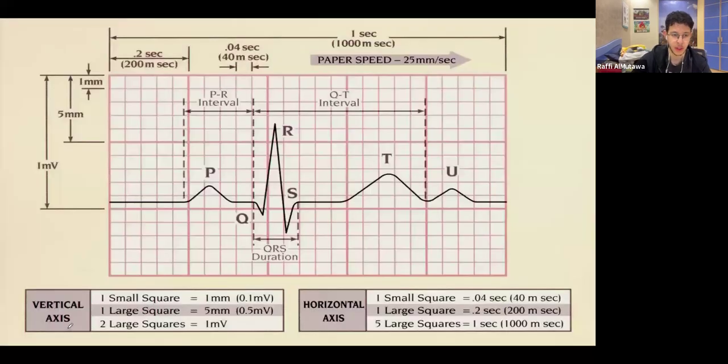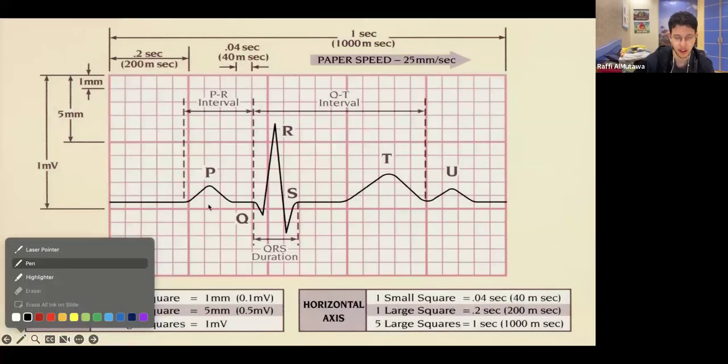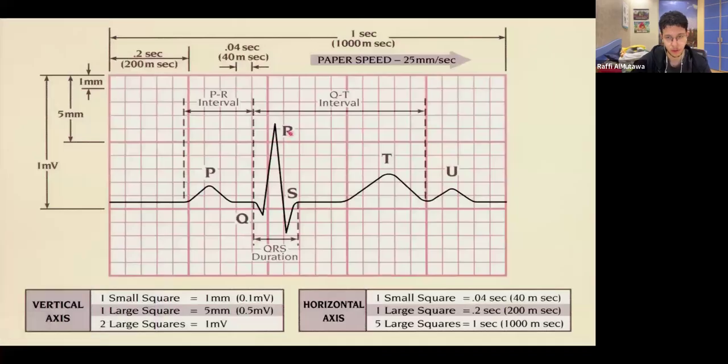What else is important? This right here. Where did I draw that? That was not supposed to be drawn. Hold up. Awesome. Okay, we got rid of that. Okay, let me think, the laser pointer might be useful for now.